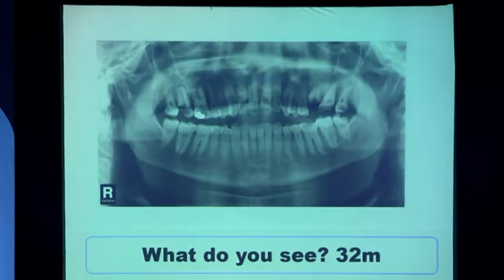This patient gives a history of trauma to the face one week back, and he says he has pain behind the ear. Look at the styloids. Are they bilaterally symmetrical? They are. There's no asymmetry. They are symmetrical. The only thing is this styloid bone is fractured. See this? This is continuous. And here it's fractured.